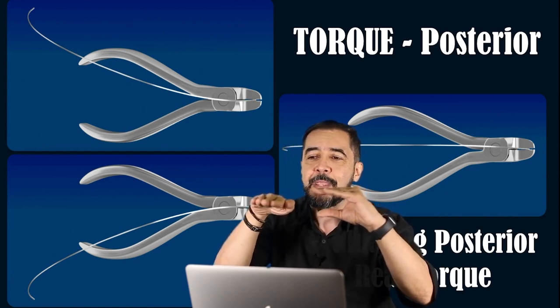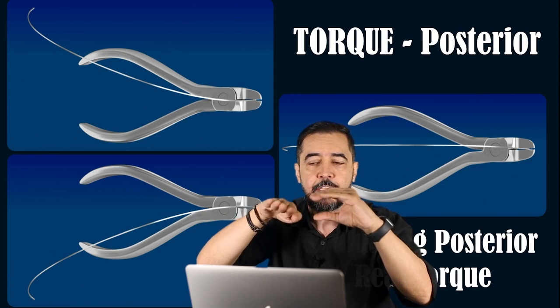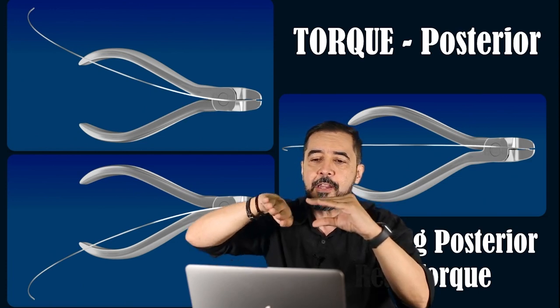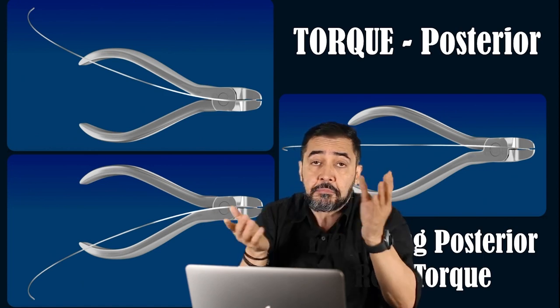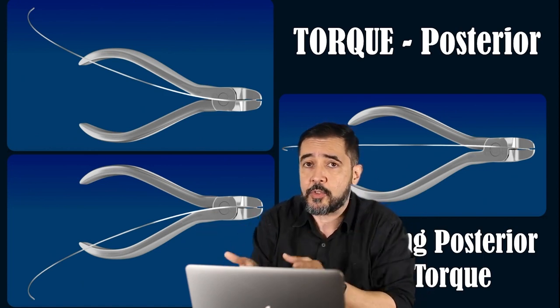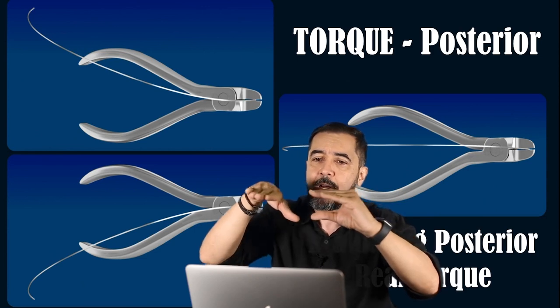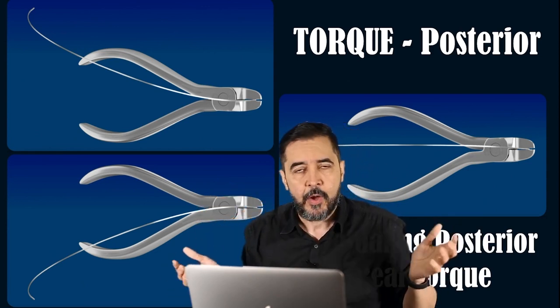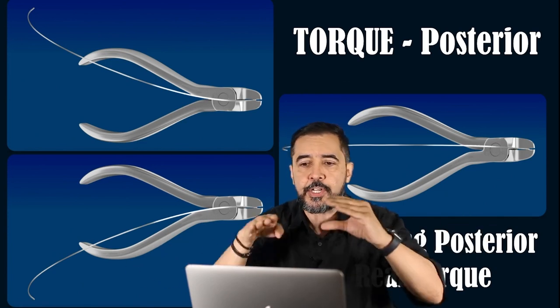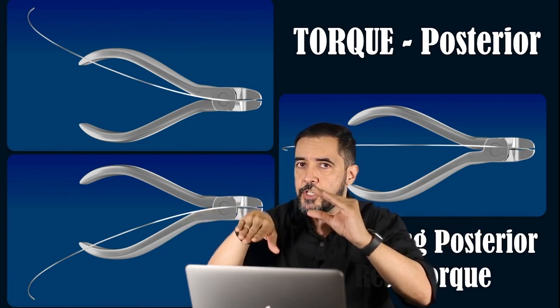So this is what I mean. When I do this or that, we make positive or negative inclinations here in the arch wire, and when it finds a different inclination here of the slot, which is obviously related to the inclination of the tooth, we will have a different relationship. We can have many different relationships between this inclination here, the real torque, and the inclination here.